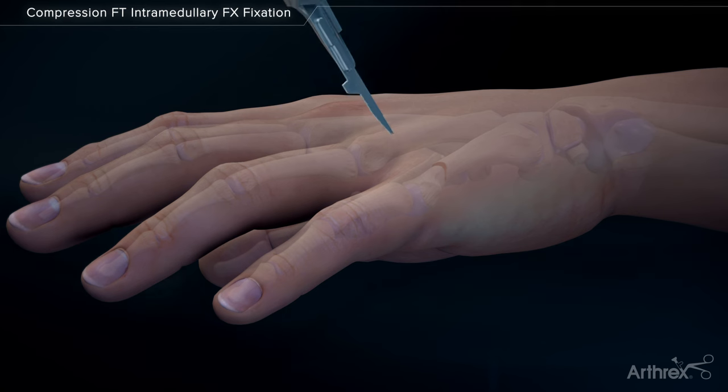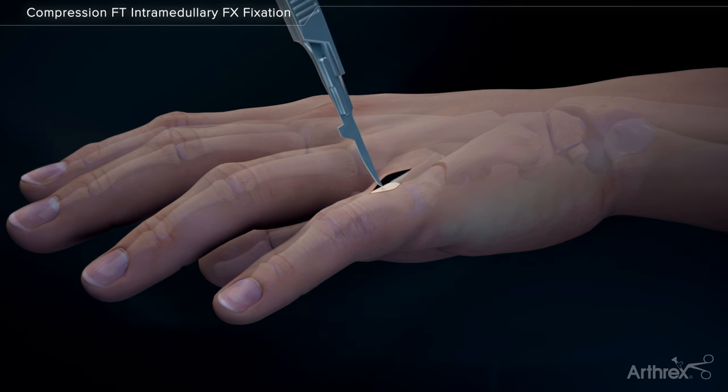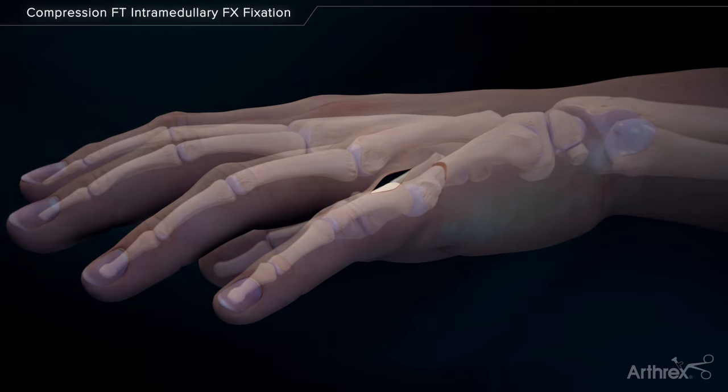A small incision is made dorsally over the metacarpophalangeal joint. The metacarpal head is visualized.